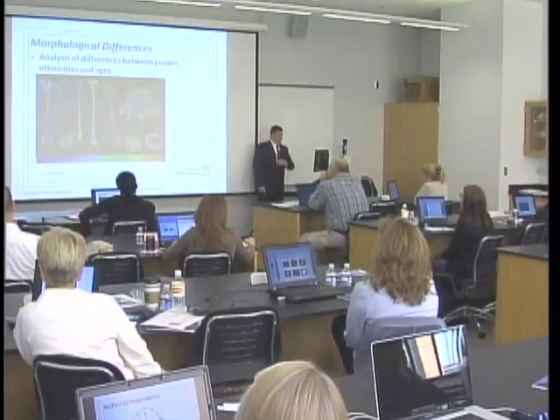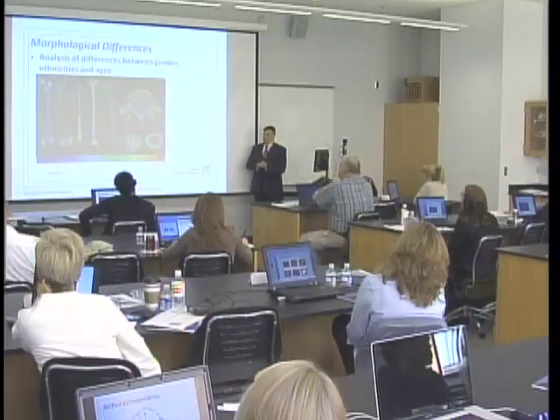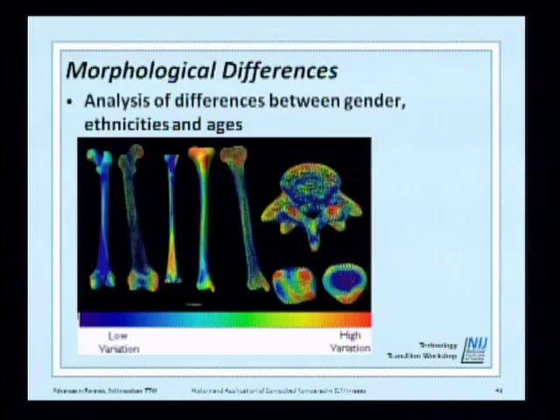Some of the earlier work that we did, and also a good part about doing it this way, is that you can identify areas with high variation. A number of PhDs came out of Tennessee using my methods in identifying the clavicle, some areas of the bone. Some people did analysis on the Lucy bone. A number of people worked on this. And this is an example. The color code tells you the high variation. So after doing this, you can rank the population and look at the areas of high variation. And then you can go after these areas and study them more.